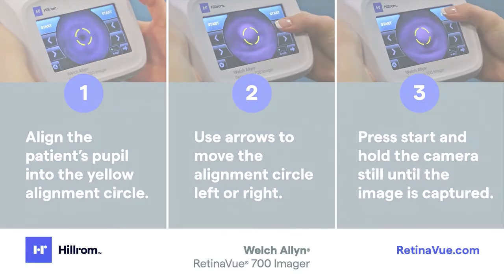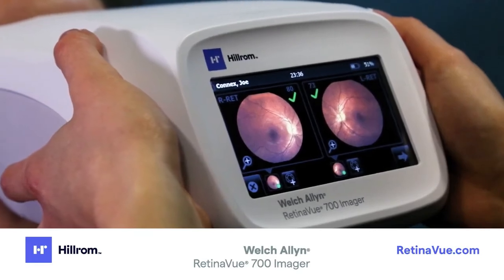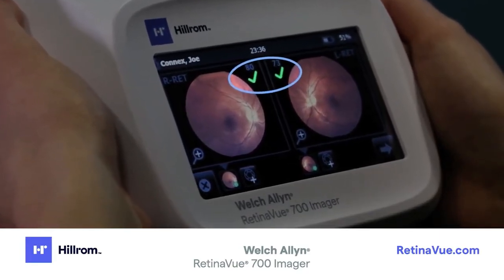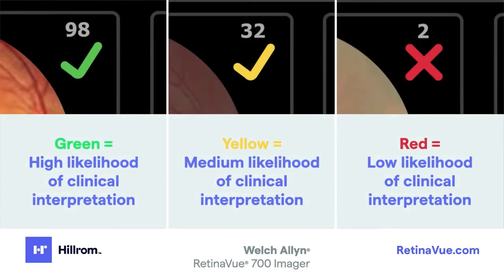Once both images have been captured, the acquired images will be displayed on the post-acquisition screen. For each image, there is a quality assessment. The quality assessment indicates the likelihood that the image is interpretable by an eye care professional. The assessment scale is as follows: Green indicates high likelihood of interpretation by an eye care specialist; Yellow indicates medium likelihood of interpretation; Red indicates low likelihood of interpretation.